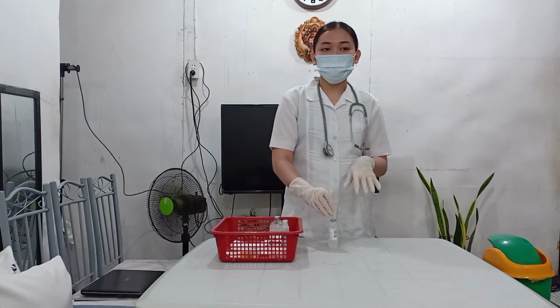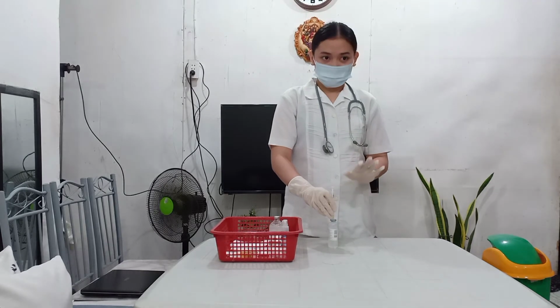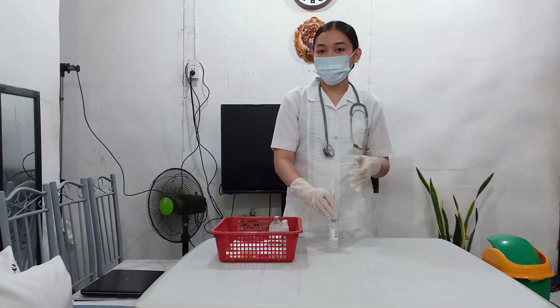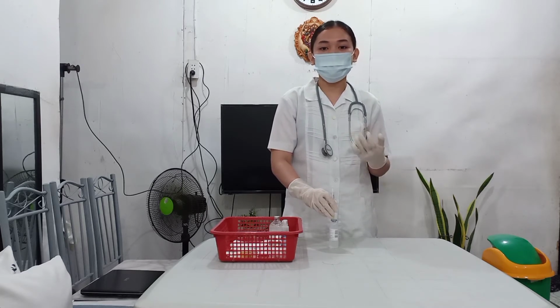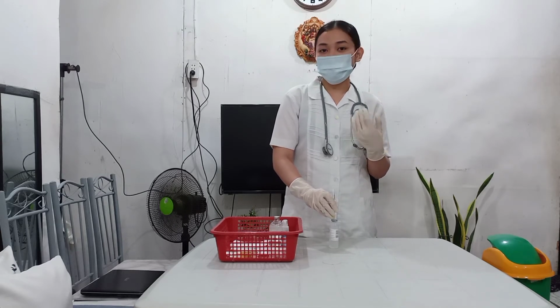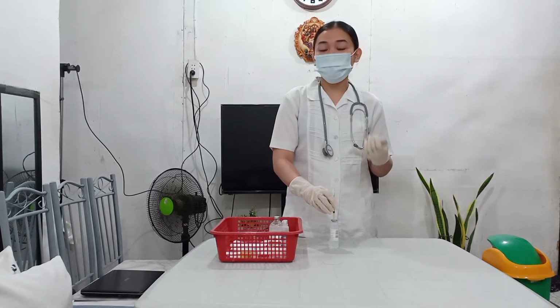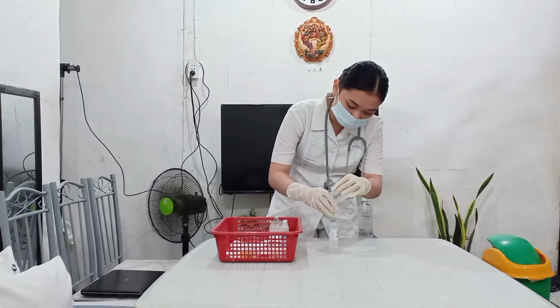Now, after we inserted the tuberculin syringe inside the ampule, we will now withdraw the amount of drug required for the dosage. This is to abide by the 10 rights to prevent medication errors and to ensure correct dosage is administered to the patient. So, assuming that the doctor ordered me to administer a 1 ml medication to my patient. Now, I will withdraw a 1 ml medication.